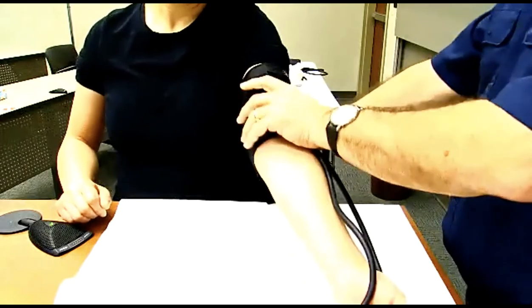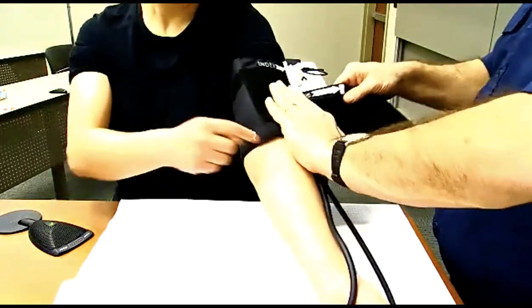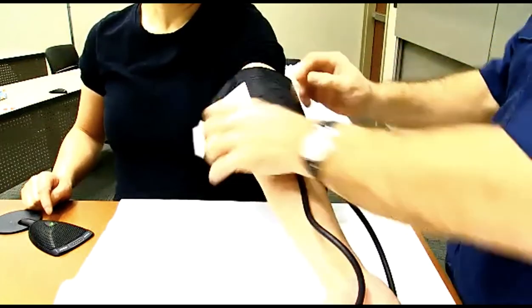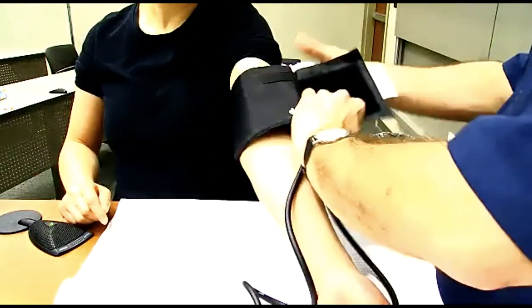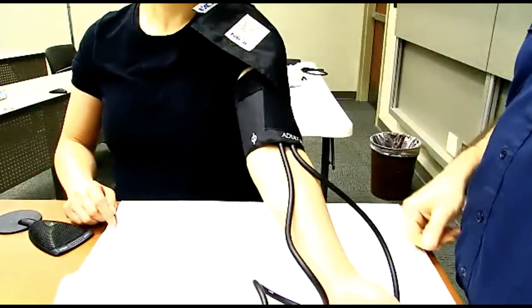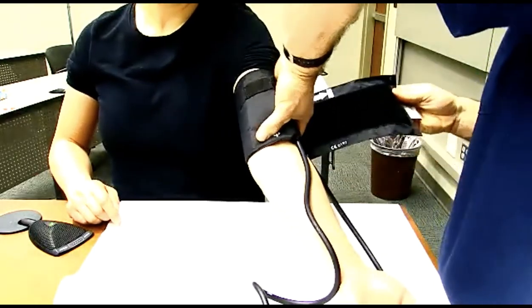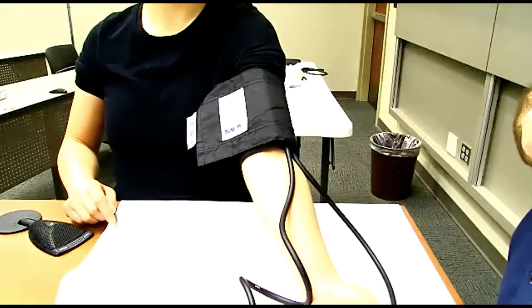Now, here's the problem. If you don't do it right, here's a couple of ways to do it wrong. What's wrong with that? You see where the circle is moved. So you want the circle to be over the inside of the brachial artery. If I do that and then put it on like this, that's good, but look, it's too loose. That's no good. It needs to be on there firmly and tightly. So again, the other thing that's wrong is to do it like this, to where it's not at an angle. So you need to make sure that when you line it up, you get the circle there, hold it steady, so that when you pull it tight, it's on there firmly and nice and even. Okay? That's how you put it on.